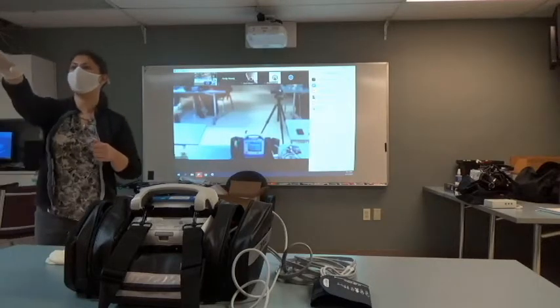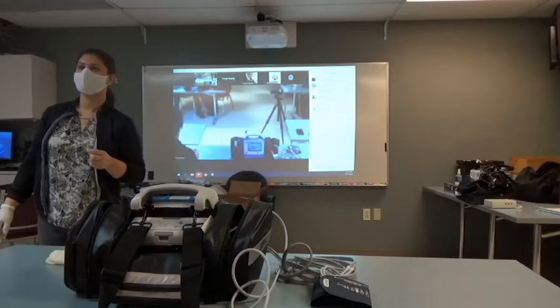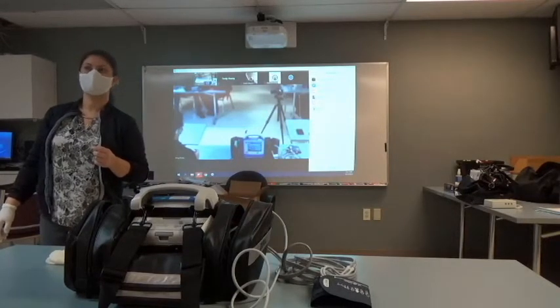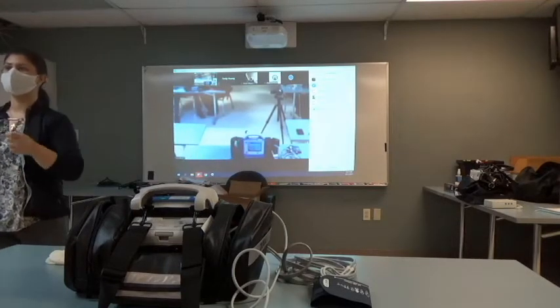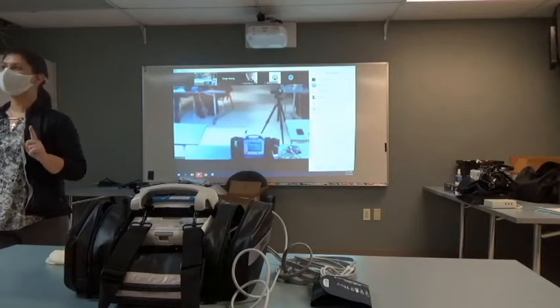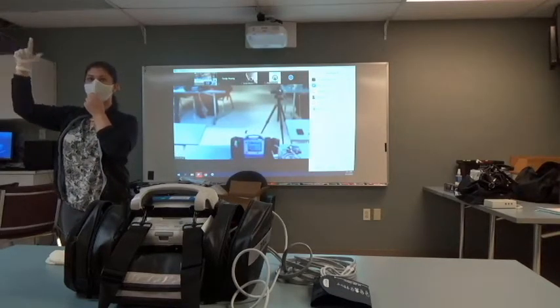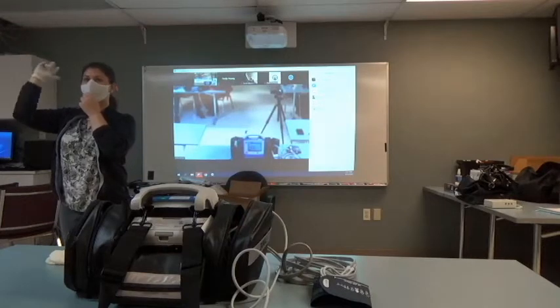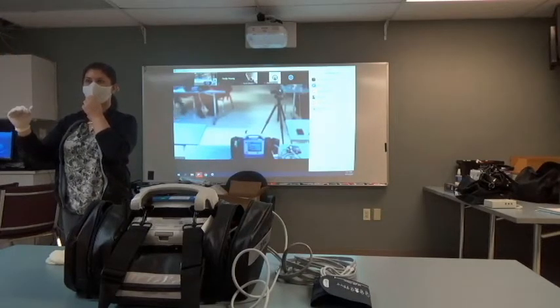And then you had a question in the back. You were so patient. That's okay. So the auto cuff will be every 5 minutes. If we manually cycle one between those, will that trigger the next 5 minute timer, or is it still going to go at the five? Okay. Any other questions at all? So we talked about turbo cuff, we talked about smart cuff, we're going to change this to autos, and we know how to override a reading. Is everybody with me?